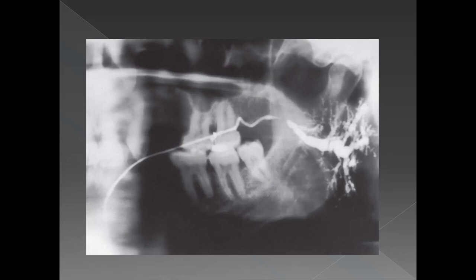The parotid papilla lies opposite the maxillary second molar. So I was saying that all this area that you are seeing over here is not the duct. This is the catheter that you have inserted into the duct. It is carrying the contrast agent, and it is present in this area over here. So your duct starts from here. I'm saying this is not the duct, this is the catheter that you have put in.